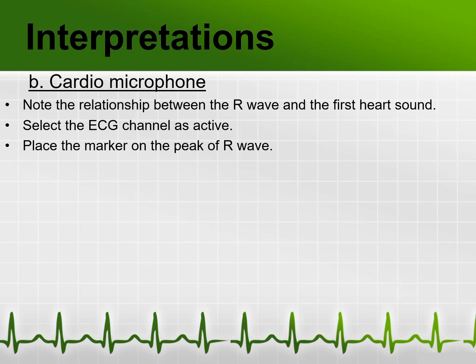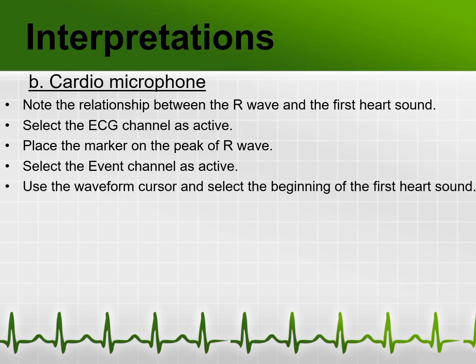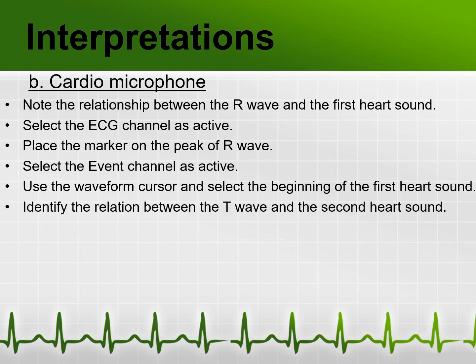Then select the event channel as active. Then use the waveform cursor and select the beginning of the first heart sound. Note this time. Then identify the relationship between the T wave and the second heart sound.